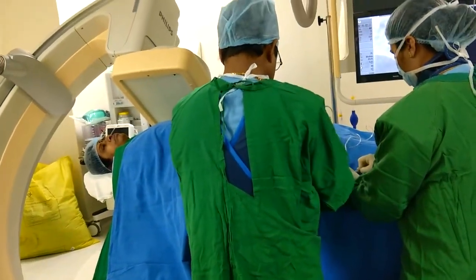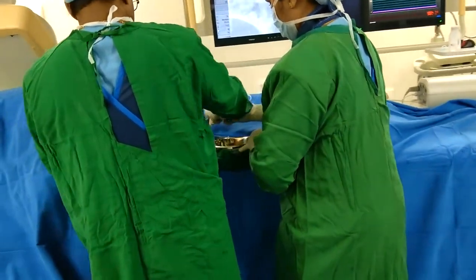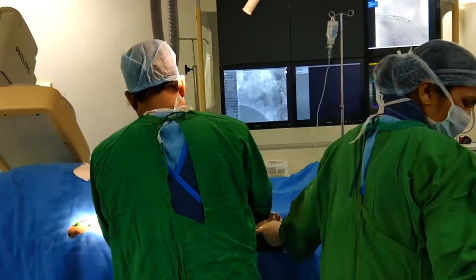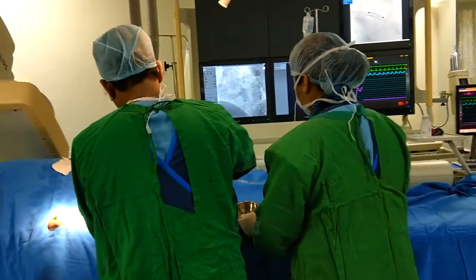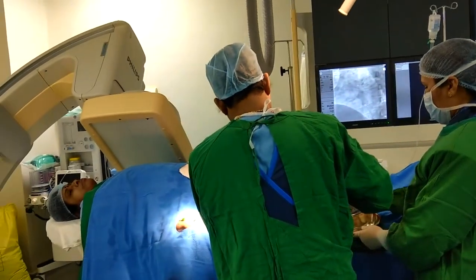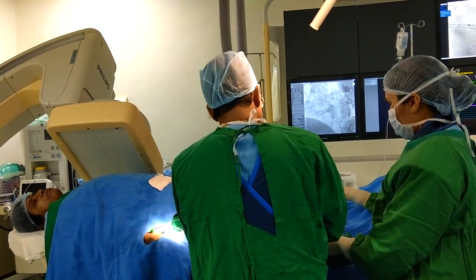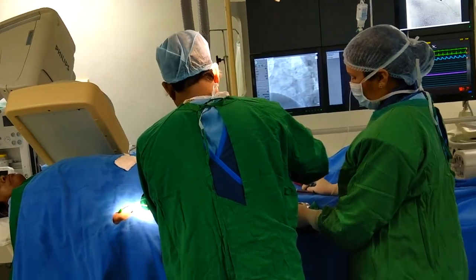This is a procedure of intravascular ultrasound. A patient with class 3 angina — angiographically we found a significant lesion which is eccentric in nature at the level of the LAD ostium.